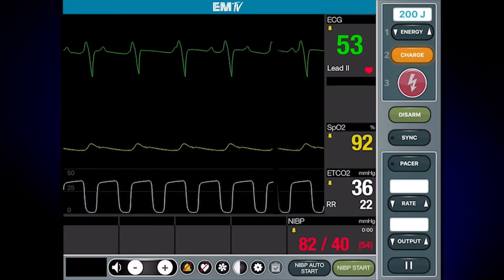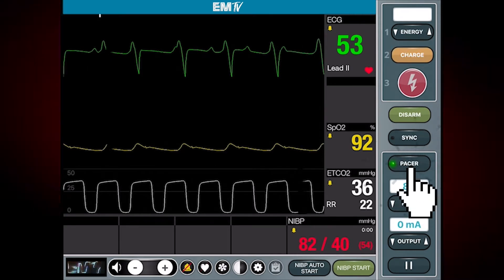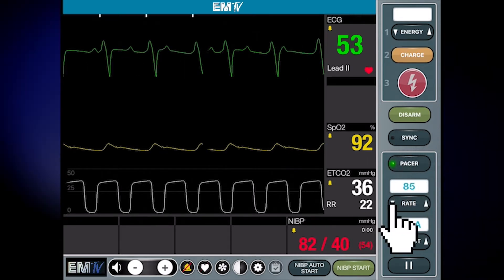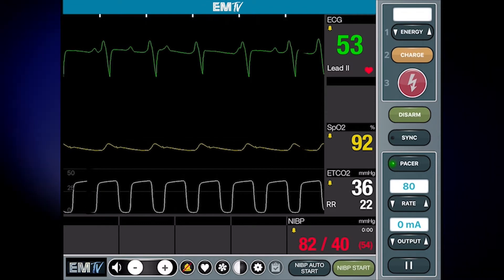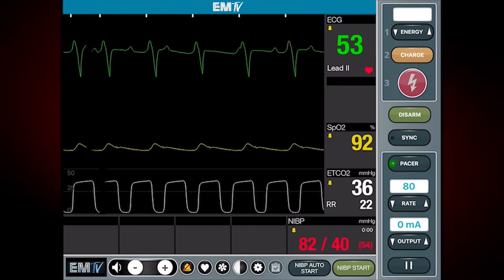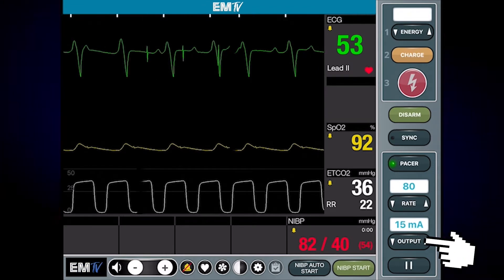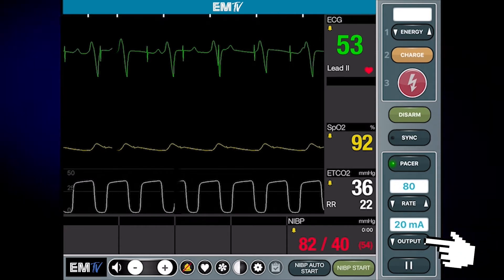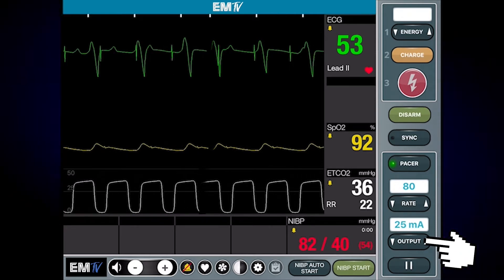First thing I'll do is turn on the pacer function. I'll then select a rate which should be within the range of the patient's normal heart rate. I'll then adjust the current and I will keep increasing this incrementally until I see electrical capture occur.